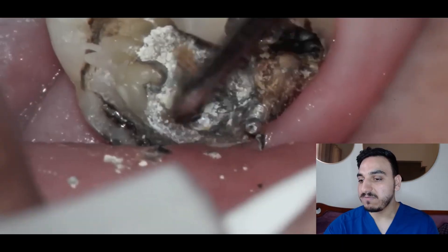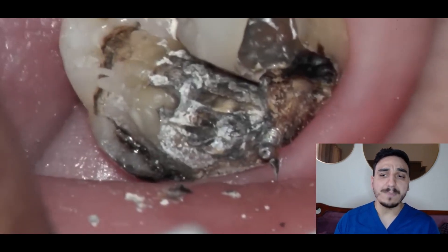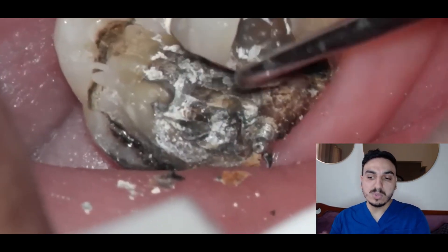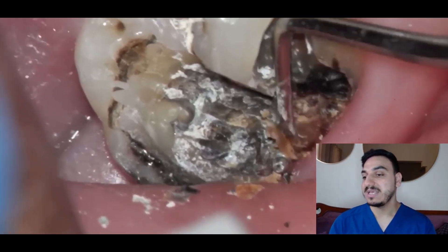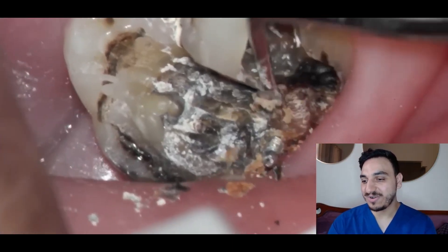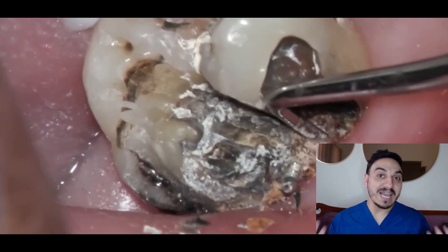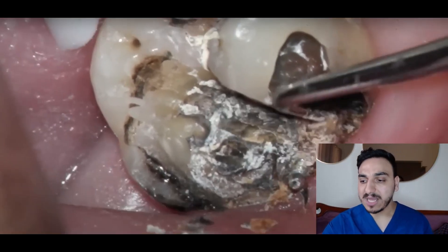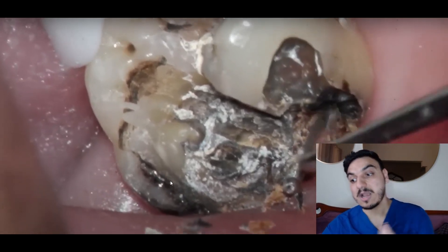Look at all of that dental decay! The operator is using what we call a spoon excavator — named because it's spoon-shaped — and it's gradually removing all of that rotten decay. Oh look at all that decay coming out — that is a whole ton of decay. There's also a challenge here: this filling is very near to the gum line. If the gum gets touched or hit by mistake, that may cause bleeding, which may complicate the procedure.